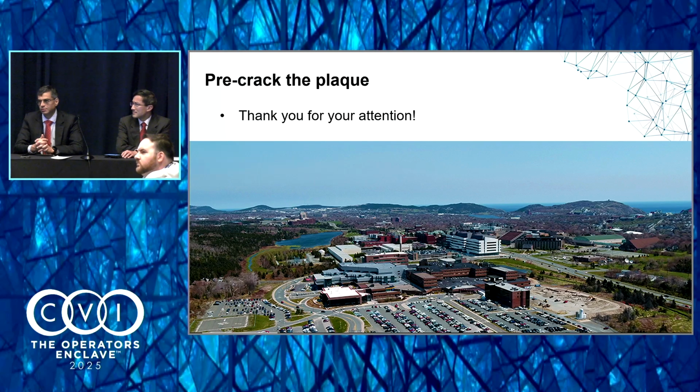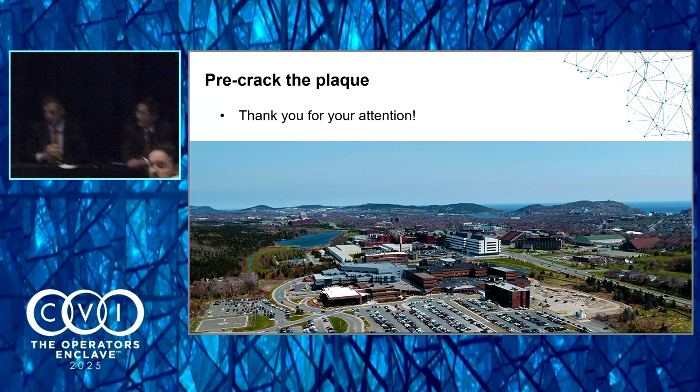But it's usually if we're using bigger balloons, high pressure for ISR. And so we're worried about the balloon seizing on the wire potentially. Is that less of a concern when you're using these smaller balloons? Maybe you're not anticipating going up to 45, 50 anyways?